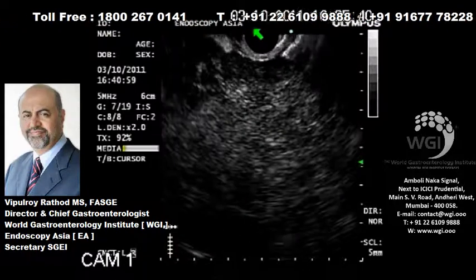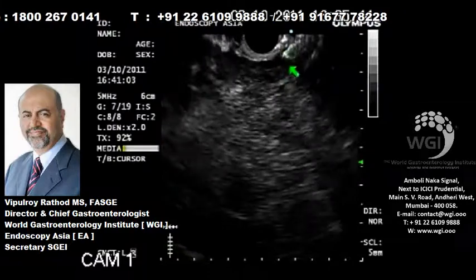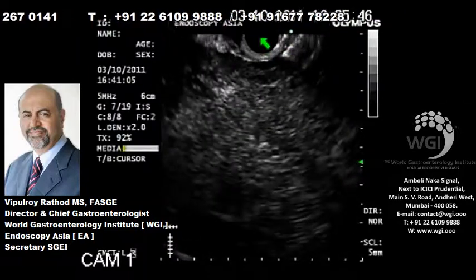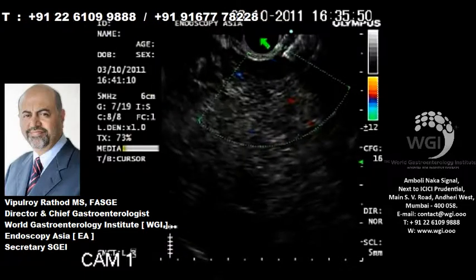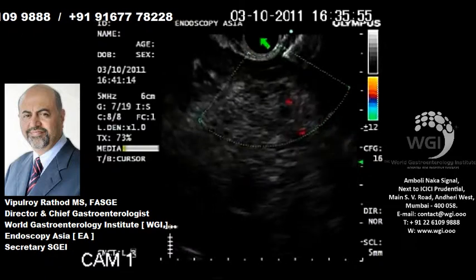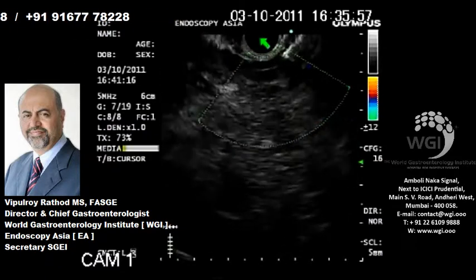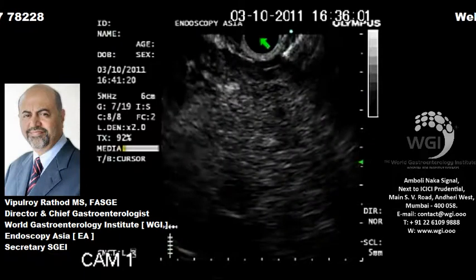So now we have our sheath abutting against it. Color Doppler signal has confirmed there is no obvious major vessel. There are few lighting up in this part. Neuroendocrine tumor may sometimes appear like this in pancreas, because they are known to be vascular.